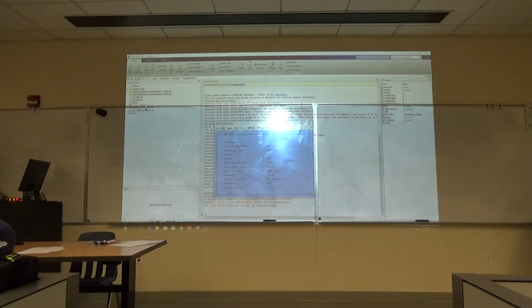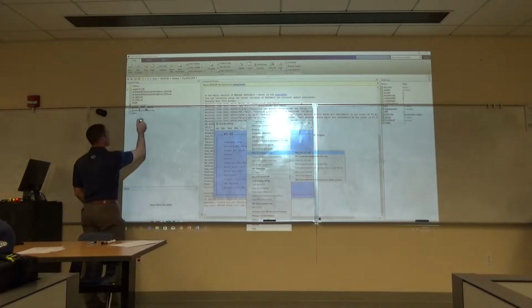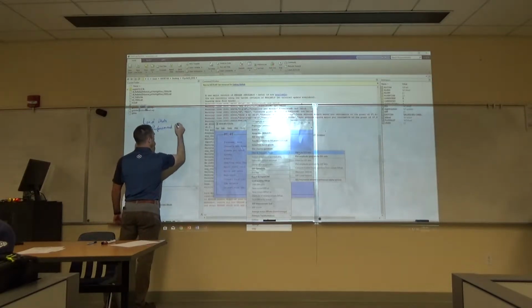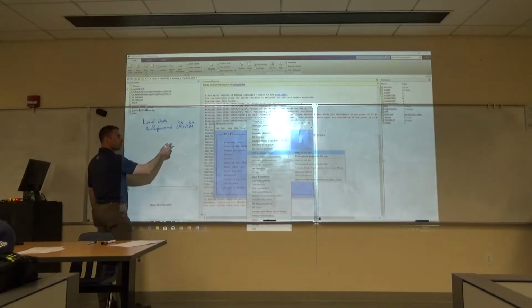So let's say the first thing we want to do is do that filter that we talked about that crashed our system last time, because we're sort of testing to see if this is going to work. Just as a reminder, first we loaded the data, we re-referenced to the left mastoid and the right mastoid, 33 and 34.